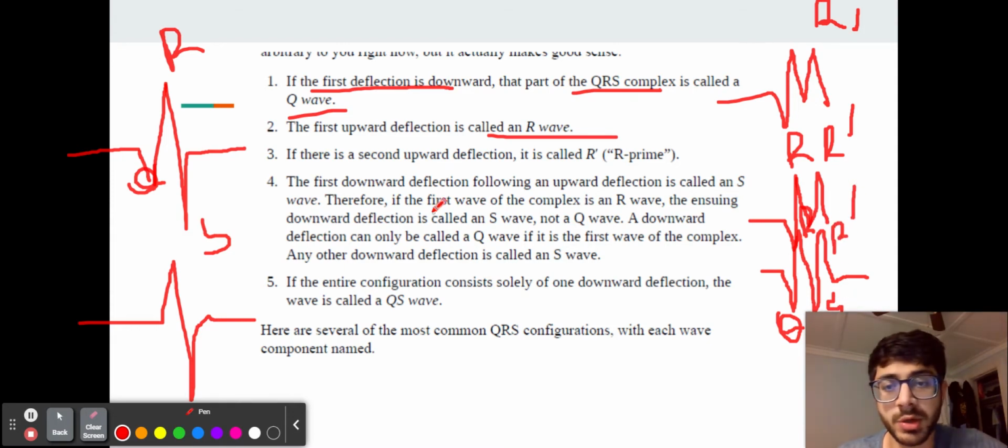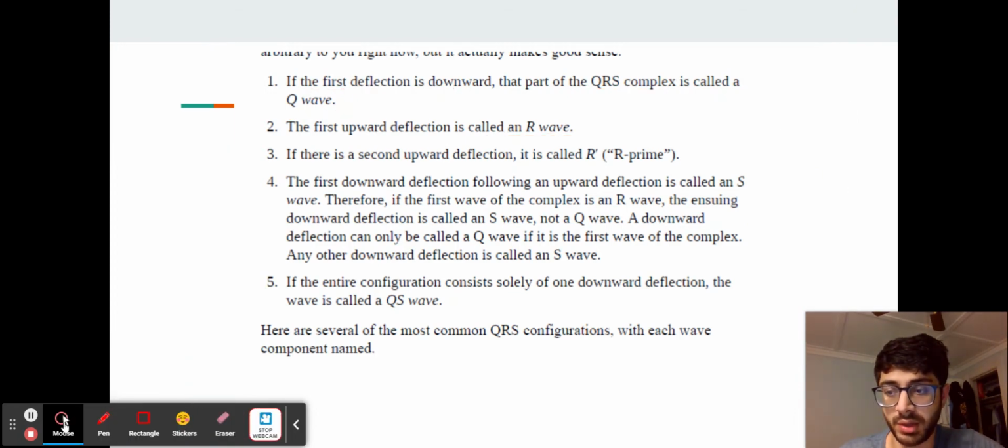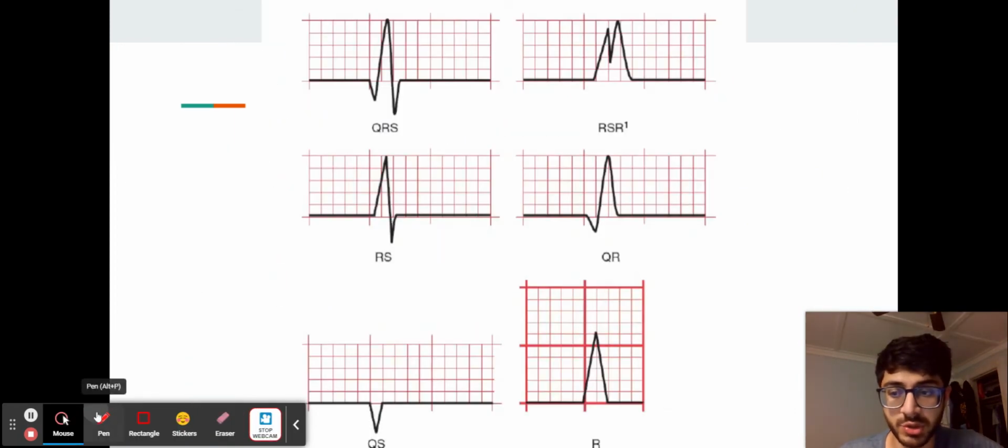So this is general terminology. You can pause the video and read this. You need to understand this terminology, and examples are on the next screen. So that hopefully will make everything clear. These are examples of everything we've just talked about.